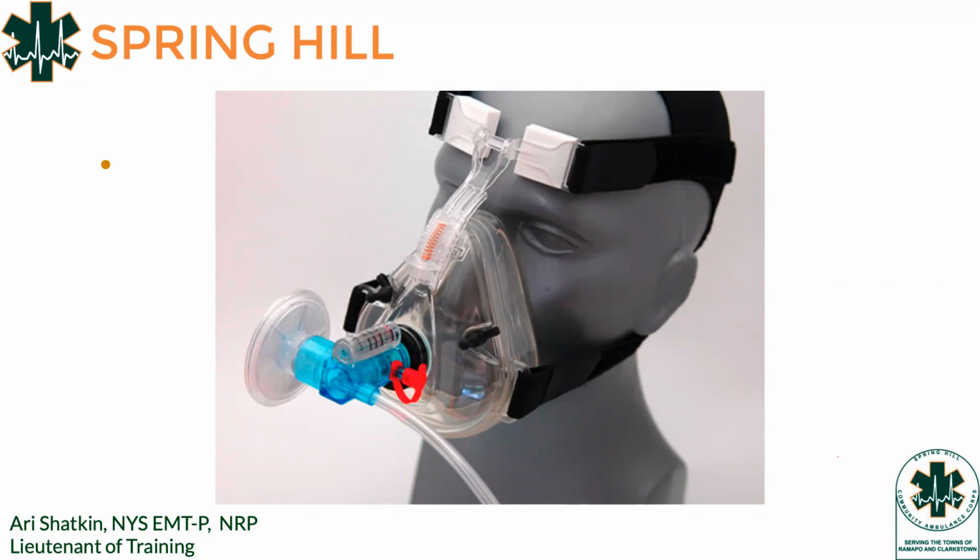So if, let's say, their oxygen saturations are still low with this, but they're getting good lung sounds now, so it's working, you could provide them more oxygen by hooking up an additional oxygen tank and just opening that to provide even more FiO2 is what it's called. And the green one is going to be used for a nebulizer, which we'll go over shortly.